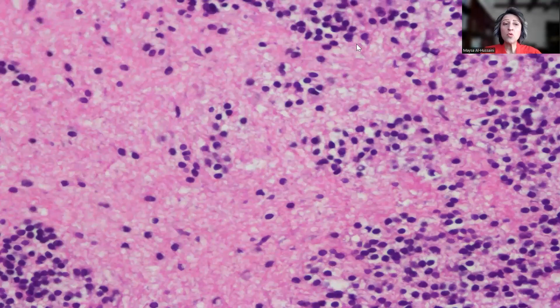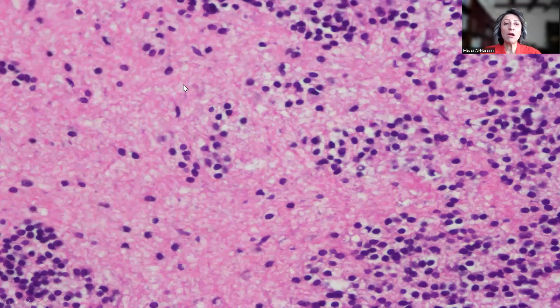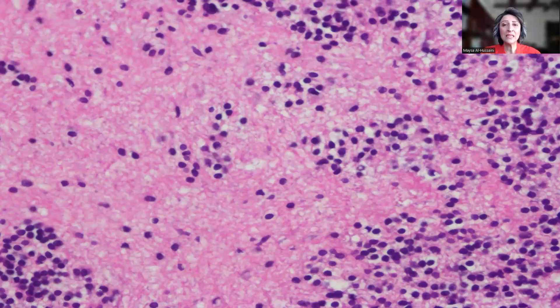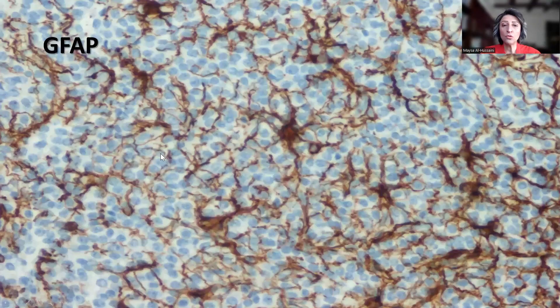A very important clue is the presence of what we call acellular fibrillary zones — large areas composed only of neuropil, with no large amount of tumor cells identified. This is an excellent clue that the case is a neurocytoma.